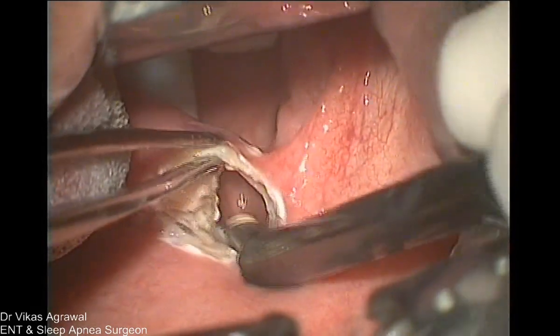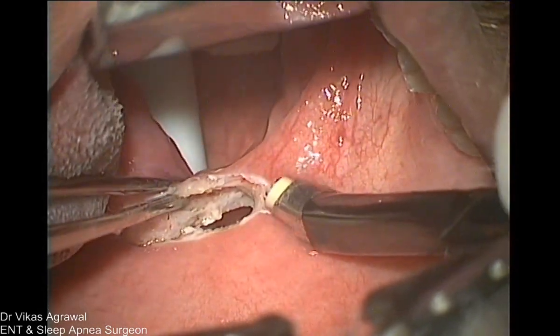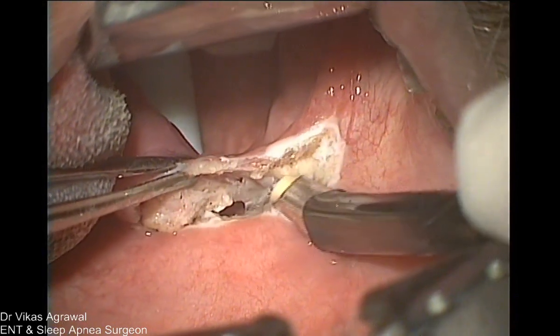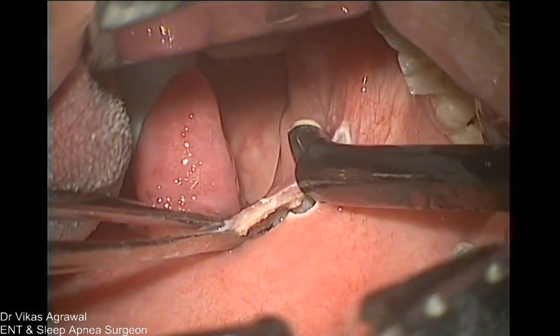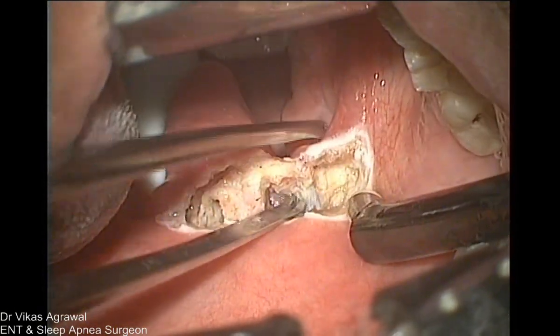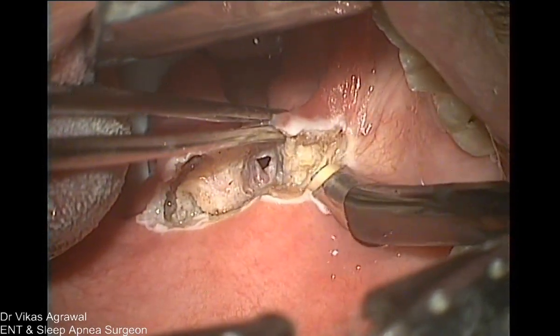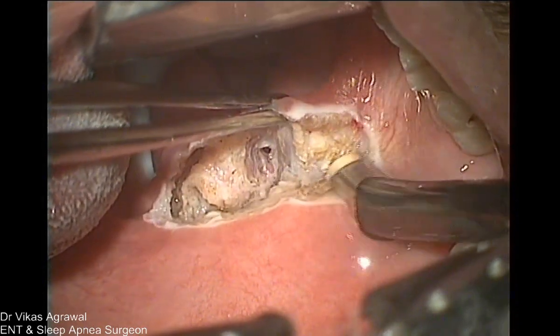Okay. So this is the posterior pillar. This is the anterior pillar. So I'll go into a little bit of anterior pillar, so that I can go into the supratonsillar fossa. Now, see, this tonsil is not looking so big, right? But see, where is the upper pole of the tonsil? The upper pole of the tonsil is pretty high. This is the supratonsillar pad of fat.